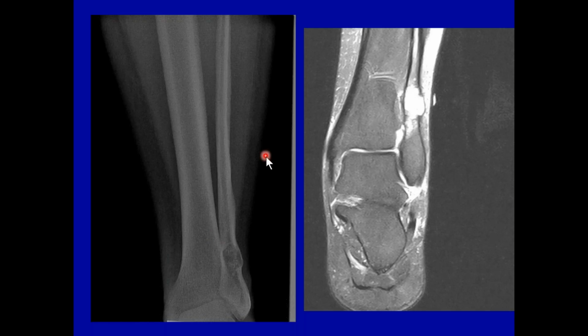So we've given you strategies, the importance of that, where to get them. Please mark all your extremities. If not, it wastes everybody's time to have to call and find out what happened, because in this case, there's something wrong with the fibula. They ended up going to the orthopedist, and on the MRI examination, which they didn't particularly need, but it was done, this is the fibula, this is the tibia, that's the talus, this is lateral, this is medial.